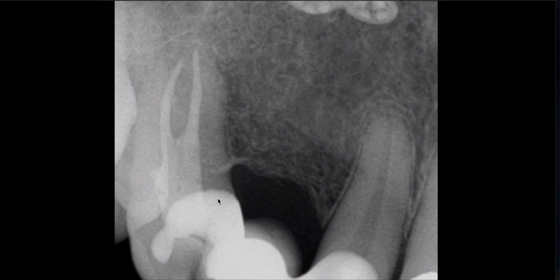And you can see this tooth is an abutment to a Maryland bridge. Guess how old this Maryland bridge is? 13 years old. I couldn't believe it. But then I looked at his bite and it's not contacting at all. That's why it survived. So we have a 2-canal premolar.